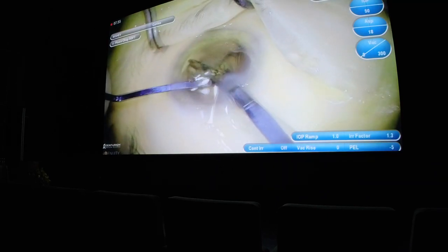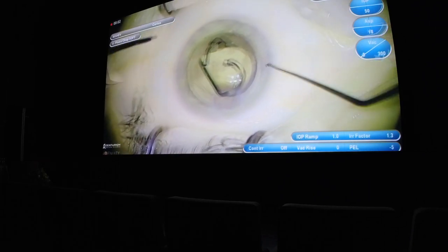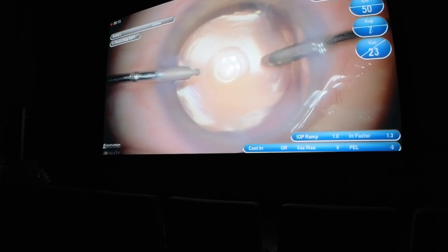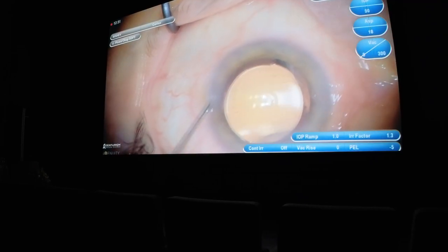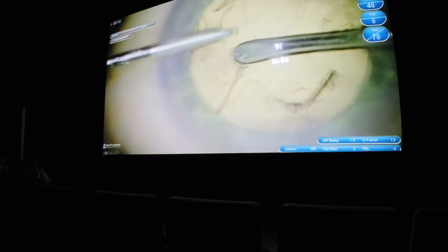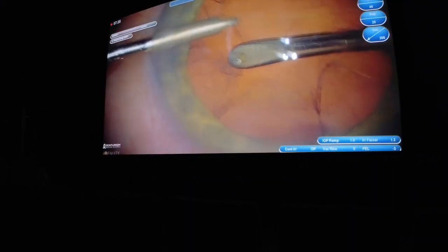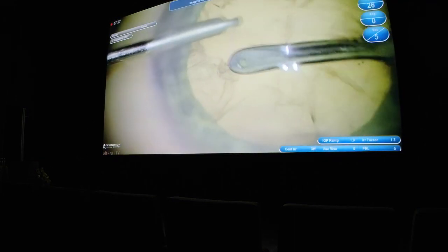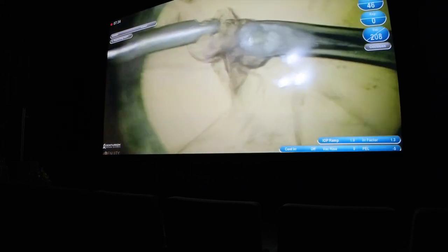This is the implantation of a 26-diopter EDOF IOL under the same filter, because the lens is also a transparent structure. This is an example of high magnification and the details we can appreciate in 3D. This is the end of this case and all the relevant parameters are shown on the screen. This is an example of the 48% magnification — you can see every detail, and you can change the image modalities and filters to best visualize the tissue of interest.